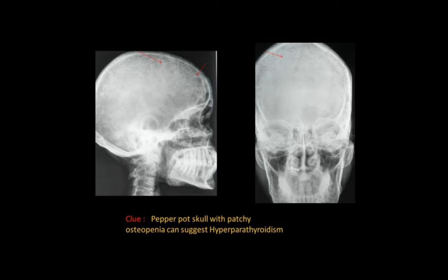This is an image of pepper pot skull with patchy osteopenia due to hyperparathyroidism. In hyperparathyroidism, the skull shows small dots like black pepper — pepper pot skull — with areas of patchy osteopenia, meaning bone weakness.